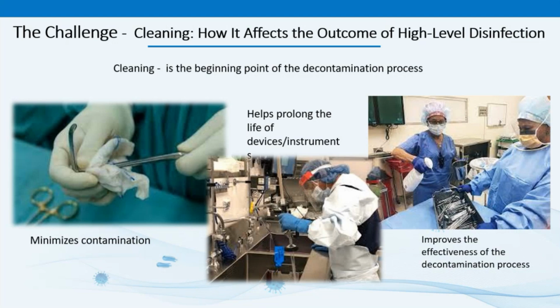Cleaning should occur again with meticulous attention to detail, to those lumens and channels and hinges and cracks and crevices. If we get this step right, we have a better chance of providing a device that's safe for patient use. Cleaning is critical for minimizing contamination from that procedural area, that point of use, to its final destination for further reprocessing. It improves the effectiveness of the decontamination process by removing substances that can dry and make reprocessing more difficult and take longer. It helps prolong the life of instruments by reducing the contamination and preventing biofilm formation. Educating staff on the importance of cleaning and how to do it can help ensure that the steps are followed. So don't skip this very critical step because effective high-level disinfection depends on it.